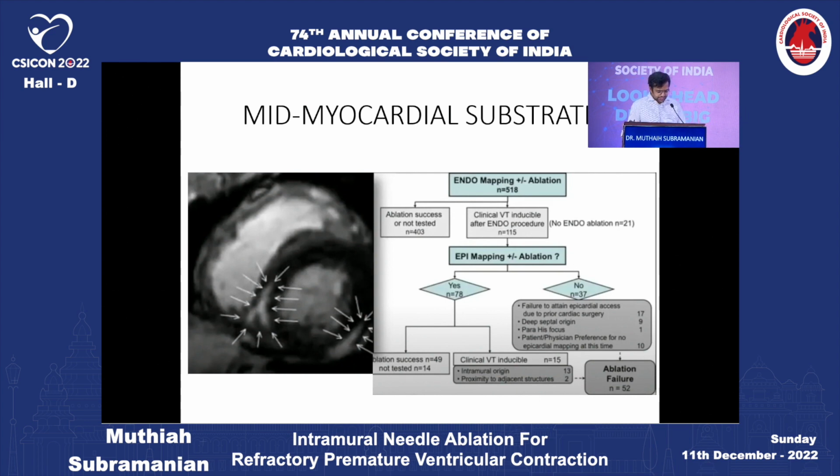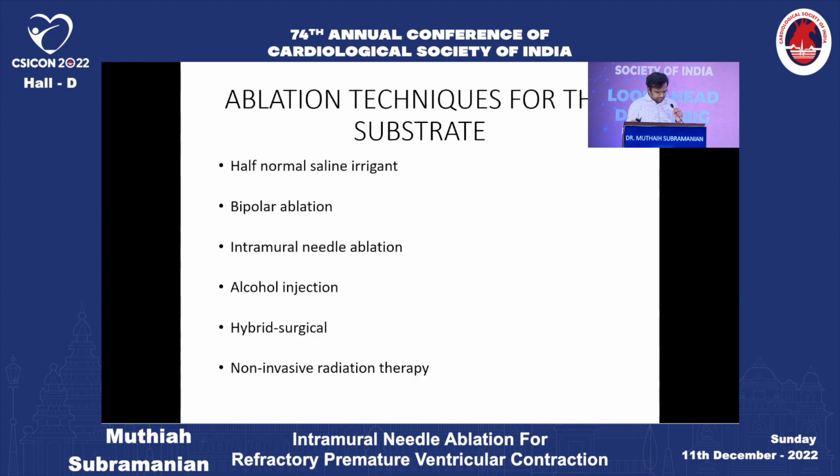40% of these patients. And this was published in 2009 by Dr. Bogan. So for this substrate in the mid-myocardial layer where endo or epicardial ablation does not work, you have to have different techniques to approach this area and to ablate successfully.